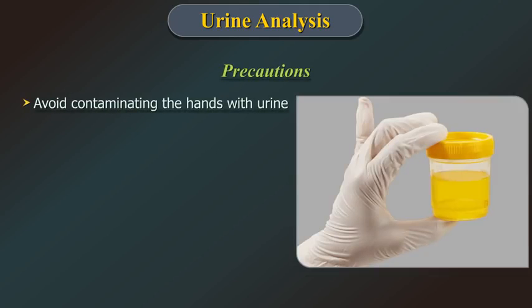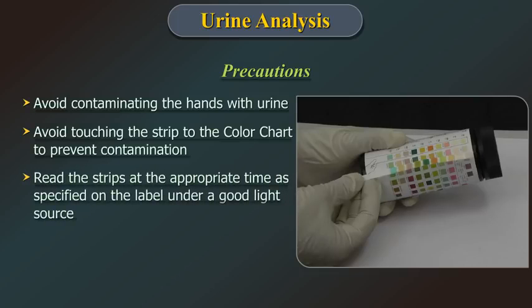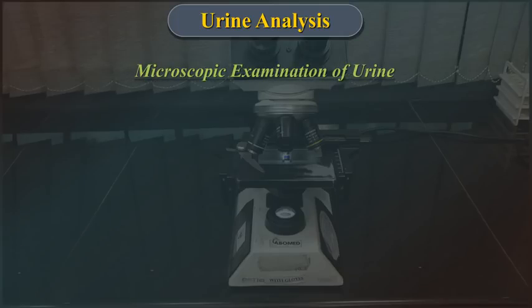Avoid contaminating the hand with urine. Avoid touching the strip to the color chart to prevent contamination. Read the strips at the appropriate time as specified on the label under a good light source. Do not read the strips in direct sunlight.